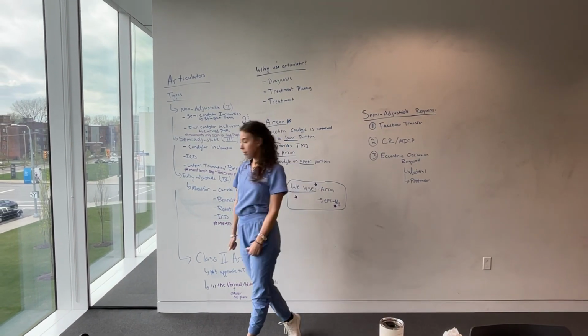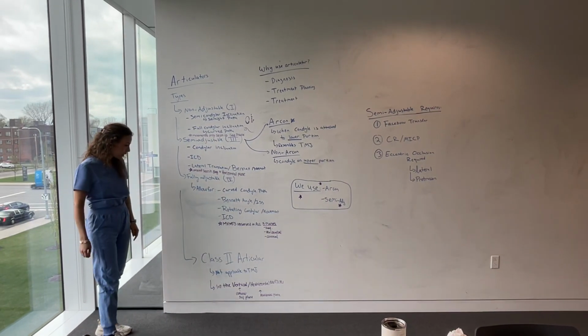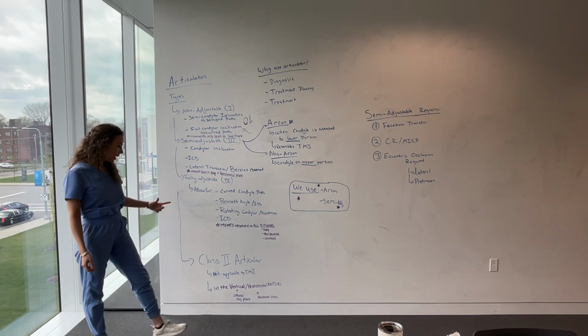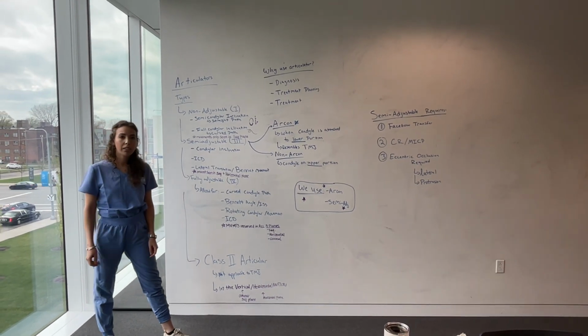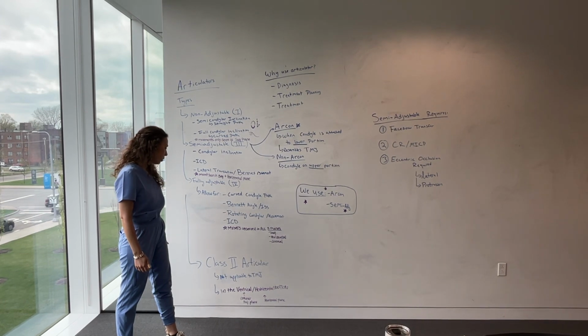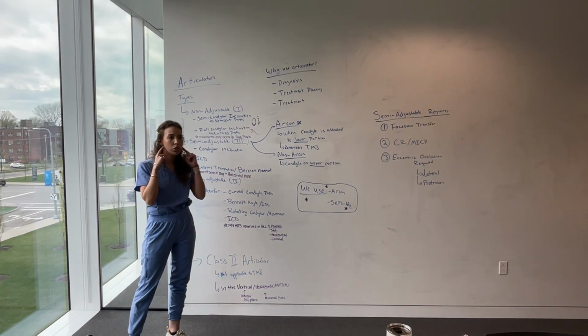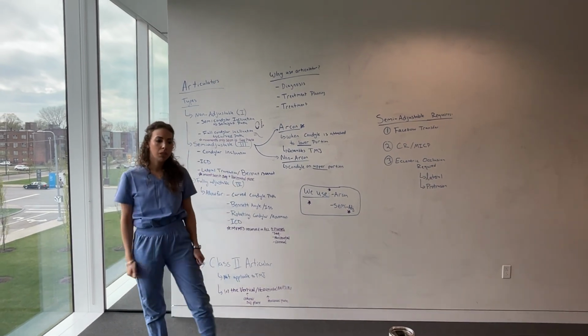And did we do class 2? Oh yeah, sorry, class 2 we don't really talk about because it's not important. It isn't relative to the TMJ. So the measurements that you're taking are vertical and horizontal motion, but they are not relative to the part of your jaw that is important. Perfect. Cool. Thank you.